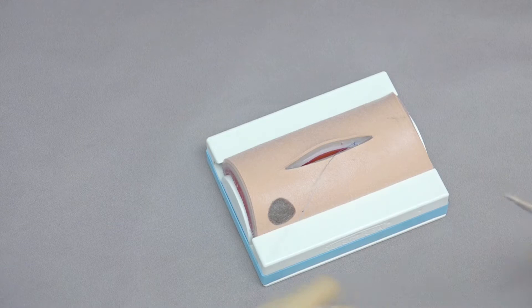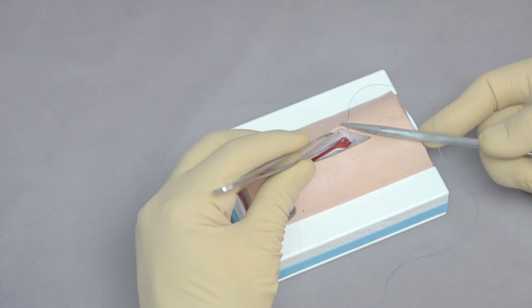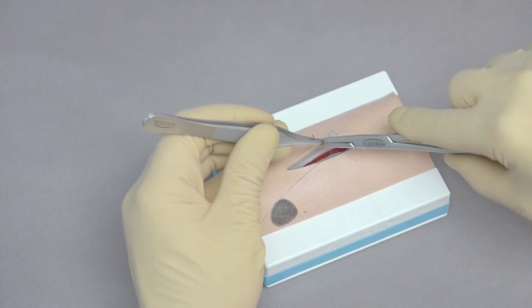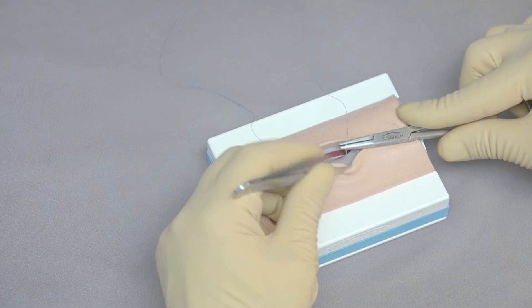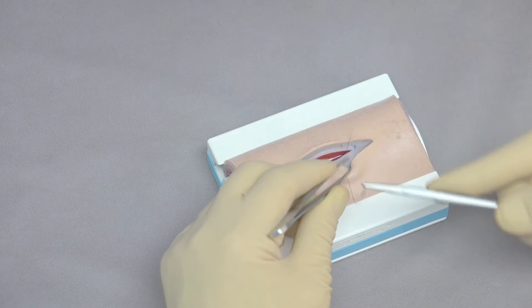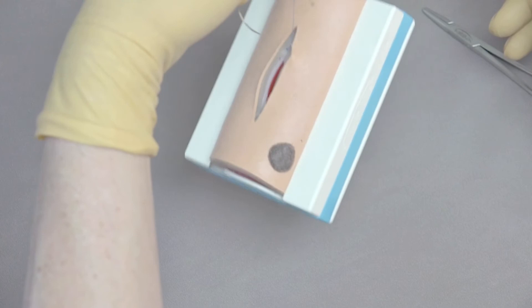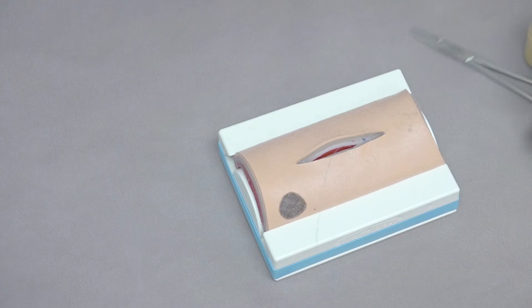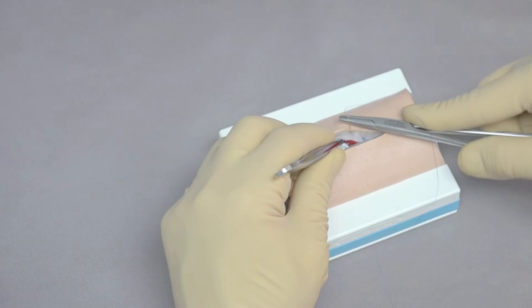To continue with the continuous suture pattern, push away again, grab the fascia, identify the fascia, get just fascia, trying to get the least amount of muscle possible. Stabilize and bring that through. Bring most of the suture through, pull the skin back, place the needle just below the fascia, push the sub-Q back to get a minimal amount, and bring the needle through. What's great about this is that the fascial layer is reinforced and very dense — you can actually lift up the whole model and tensioning base with the suture going through the fascia, which really replicates what we typically see with the fascial layer. Reposition the needle to continue in the continuous pattern with the external fascial layer, tightening along the incision to bring it to better proximity and maintain tension.